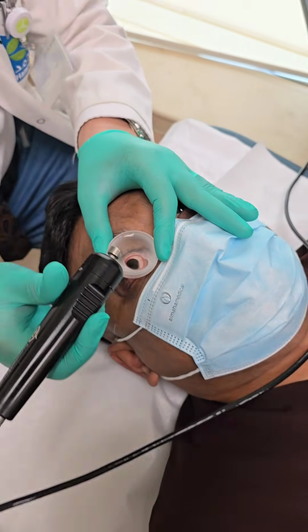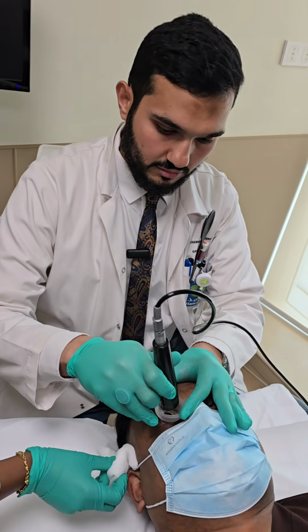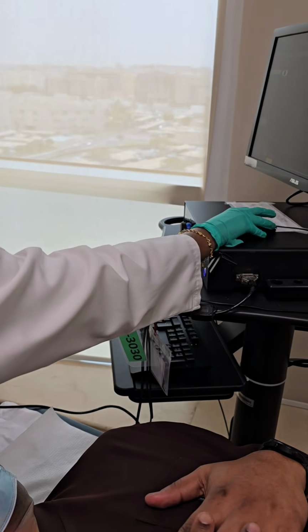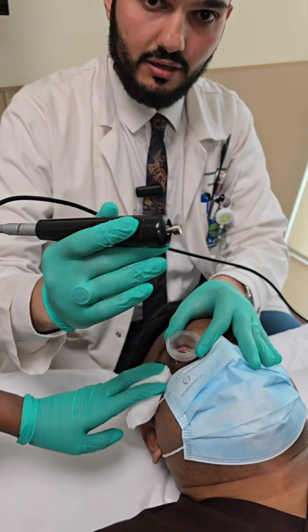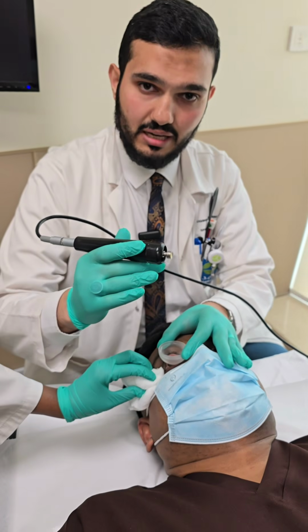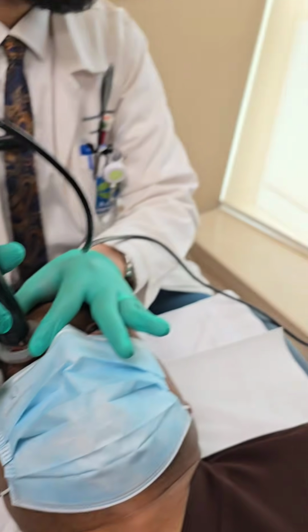After that, this is the transducer. You will hit the button to start the scan. Start the scan. Okay, see the movement of the transducer. It moves within an area of 5 by 5 millimeters, with horizontal lines, taking pictures line by line until 512 lines. We'll put it like this, look straight, and see how the immersion technique works.